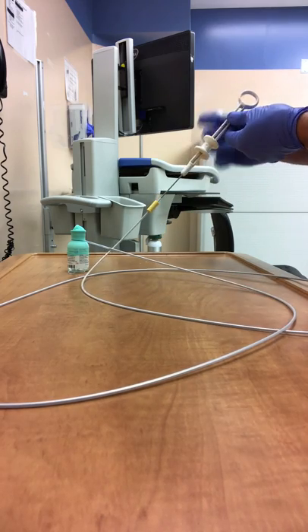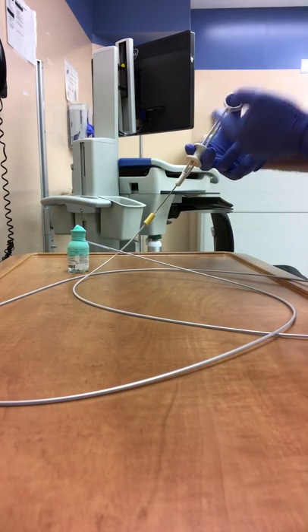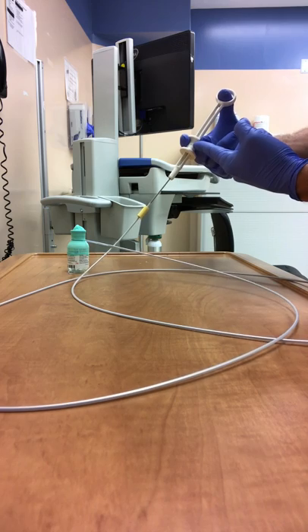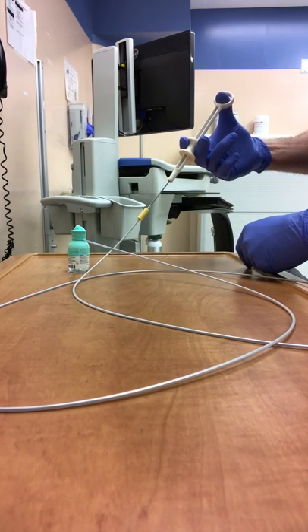Once you're comfortable with the position, you'd like to now tighten the loop and then switch to the spool and thumb ring and squeeze these together in order to tighten the loop the same way you would with a snare.